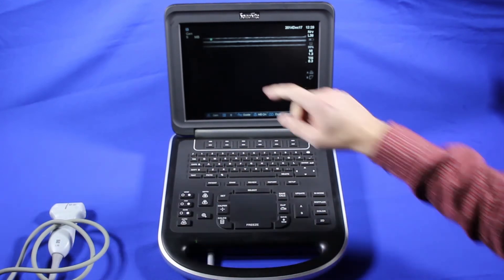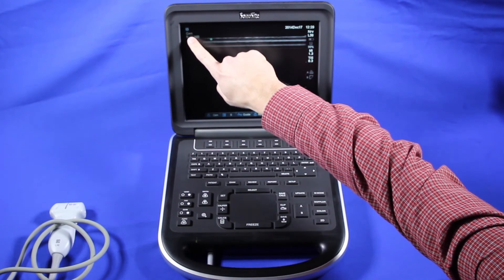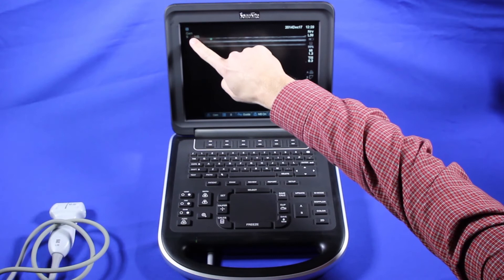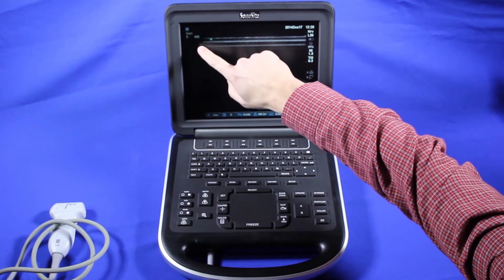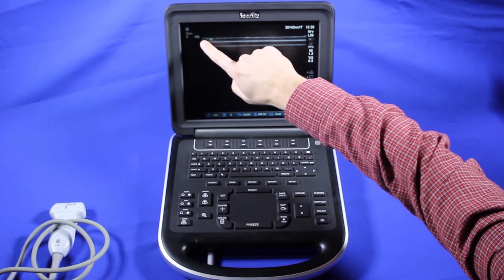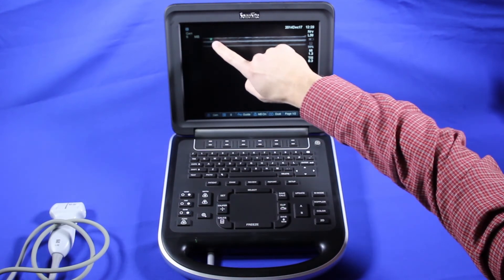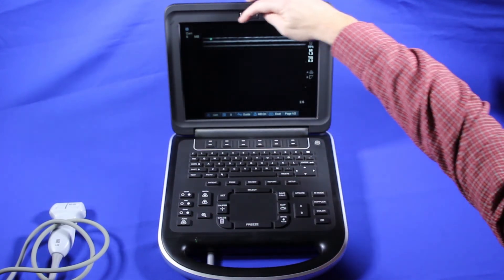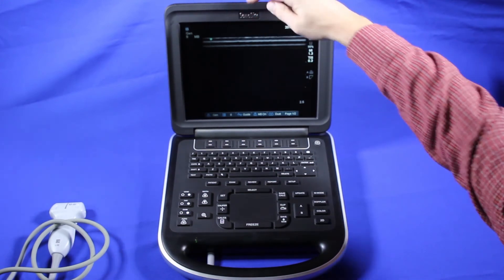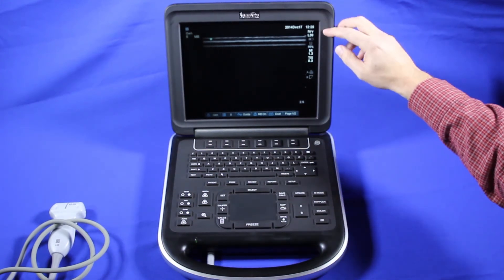Let's go around the screen. Up top, we have the SonoSite logo. This says GEN for general imaging — we can change it to resolution and penetration. It tells you the optimization mode that the system is in, as does this as well, and here for SONO MB. Your orientation marker, the date, and your patient information will go up here. You select in the setup what patient information you want on the screen.